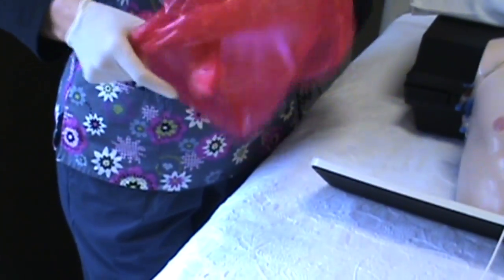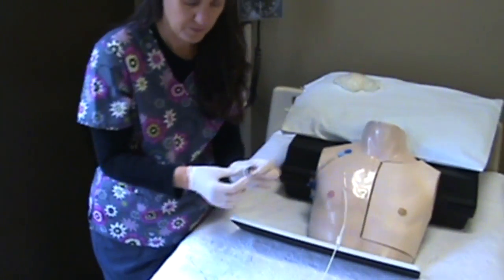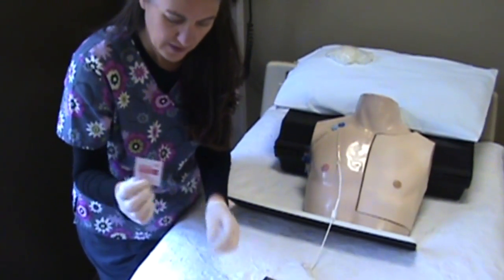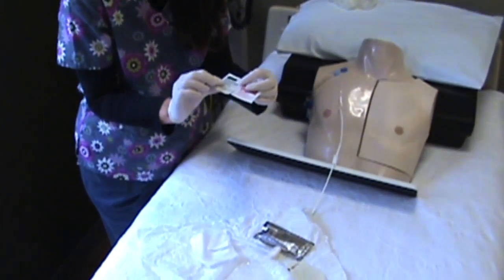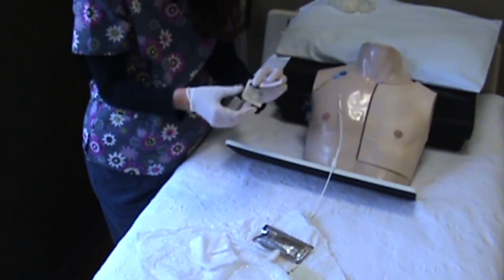So we'll open up your red bag for the trash, put it off the sterile field. This tape right here is just for extra security when you put the dressing on. A little alcohol prep, and this is also a skin protection prep you can take and put around the skin here to hold the tegaderm on if needed.